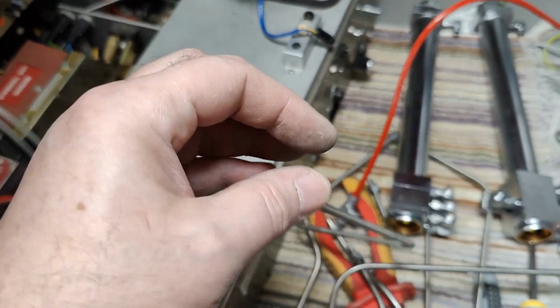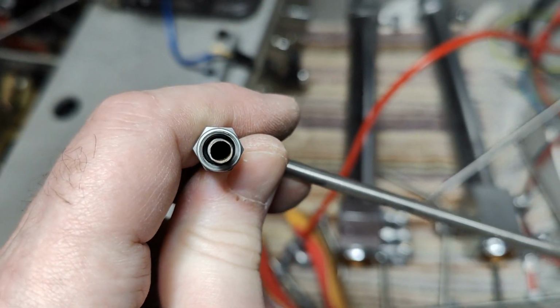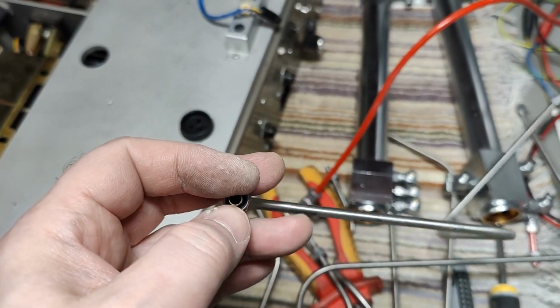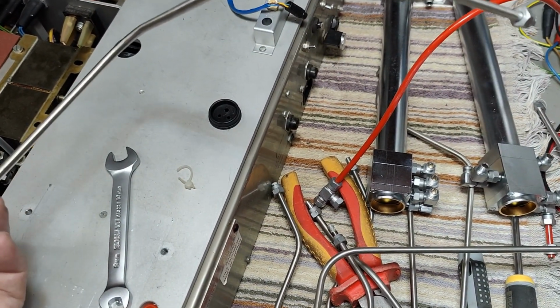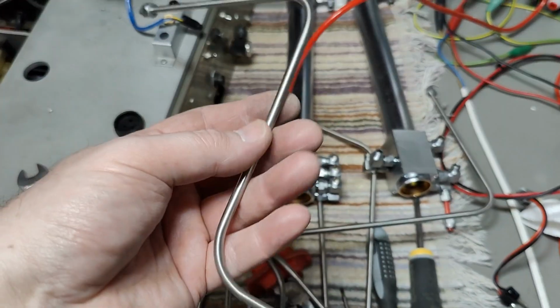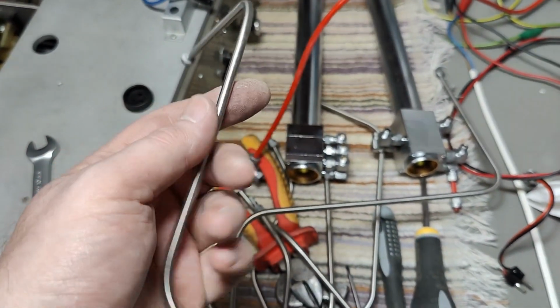It's just because, look at that. The wall here is thin as paper. And I bet that is because they want the highest possible inner diameter for whatever gases it is they're putting through this, right? But they are just light as air. This is so amazing. Obviously, they're most likely also quite fragile, so I try not to bend them.